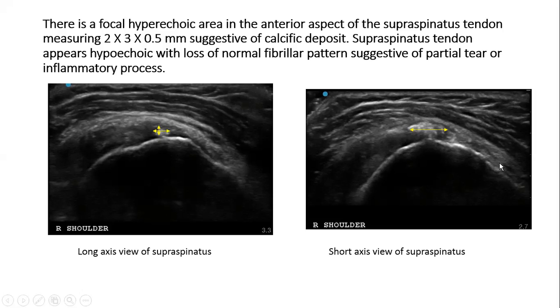You don't see much here. This is not the tendon. This is where the tendon ends, and this is the posterior portion. If you keep on going, you will see the infraspinatus and teres minor, somewhere around here. Again, I think I just have it backwards in my head. The orientation? Yes. Yeah, it happens.